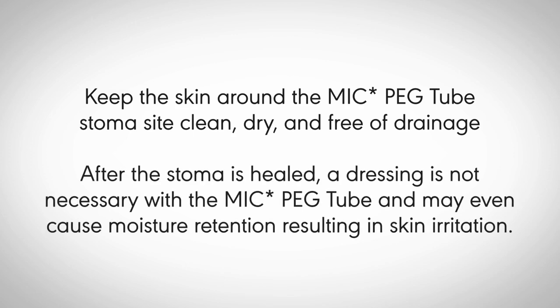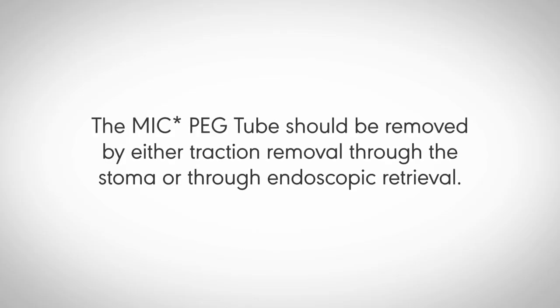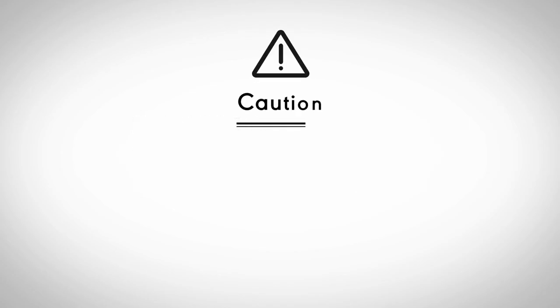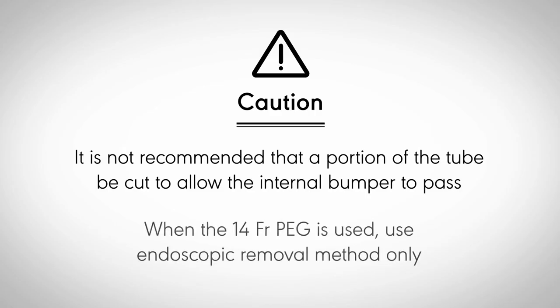After the stoma is healed, a dressing is not necessary with the MIC-PEG tube and may even cause moisture retention resulting in skin irritation. The MIC-PEG tube should be removed by either traction removal through the stoma or through endoscopic retrieval. Caution: it is not recommended that a portion of the tube be cut to allow the internal bumper to pass. When the 14 French PEG is used, use the endoscopic removal method only.